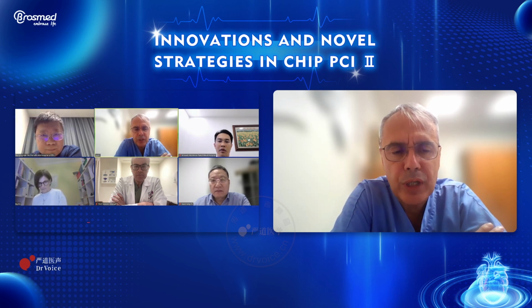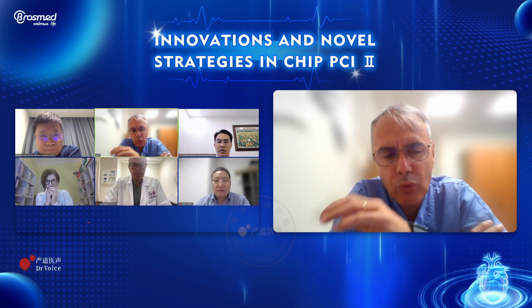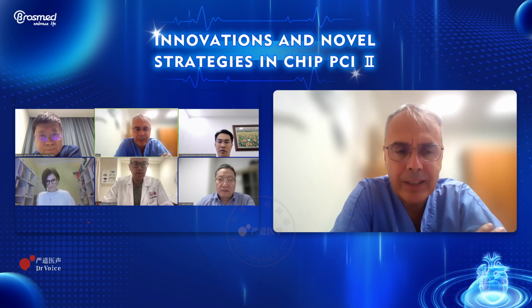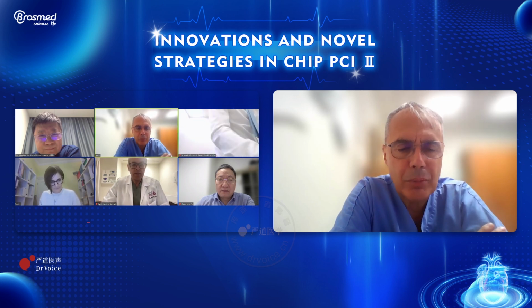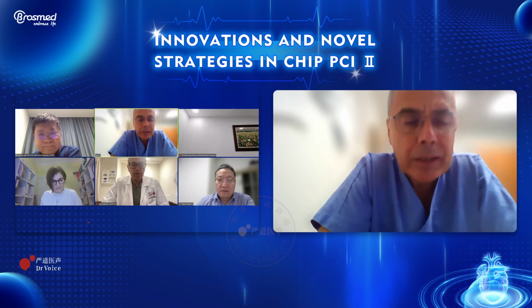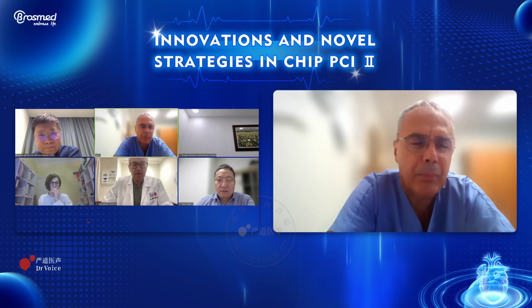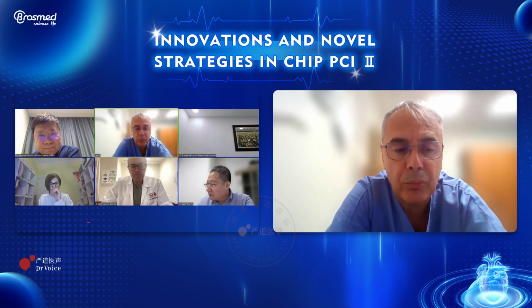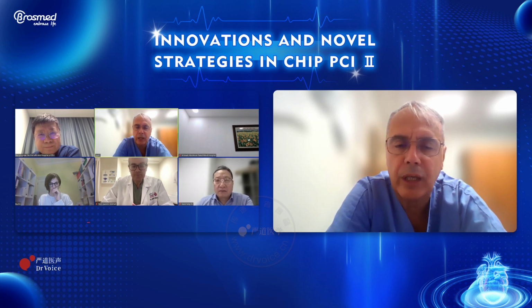And probably if you want to use a more aggressive Revo Edge, so if you want to prepare the lesion very well, we move to 3.0 Revo Edge or 2.75, especially in the mid proximal LAD. But I appreciate a lot how this technology could help us prepare the lesion very well, especially if you want to use a combination hybrid procedure like DES and DCB. Thank you for your case.